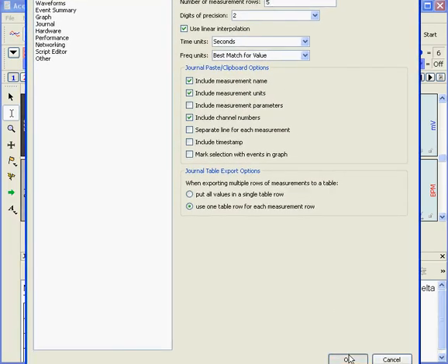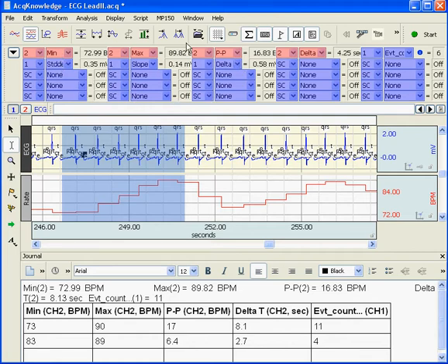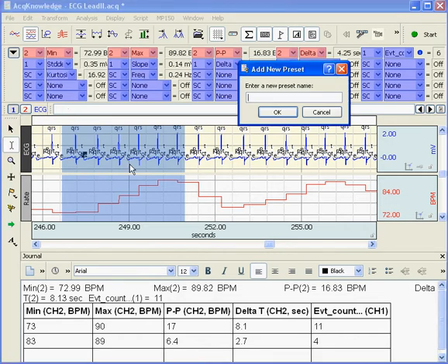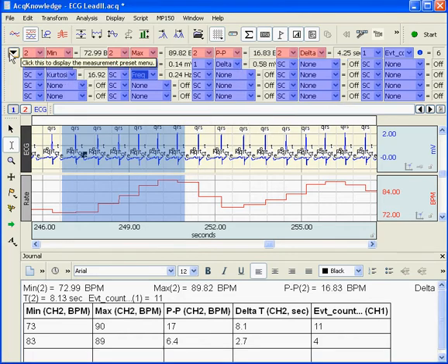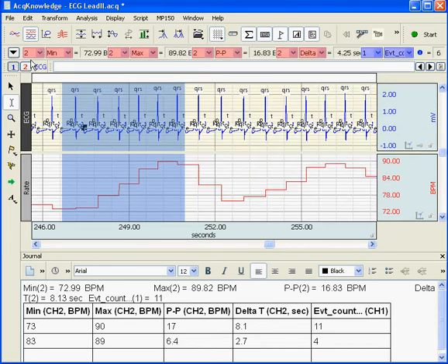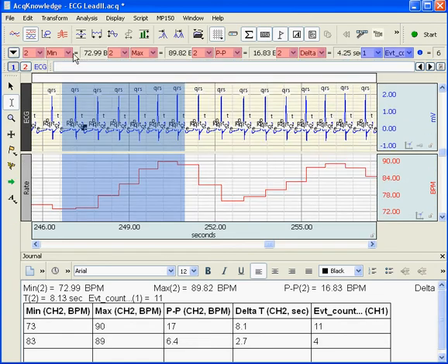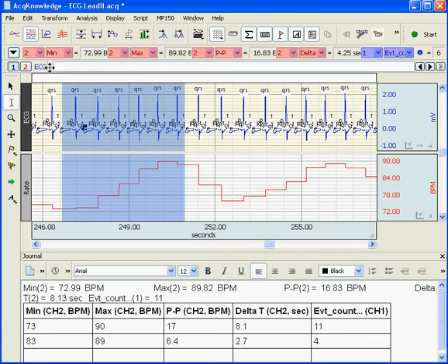So now I have got five rows of measurements and I can turn these measurements on as I choose. I can select New Preset and enter a new label for that preset. Now I can toggle back to my original preset — min, max, peak to peak, delta, time, and event count — and back to my test. This preset will always appear no matter what file you open within this version of Acknowledge.